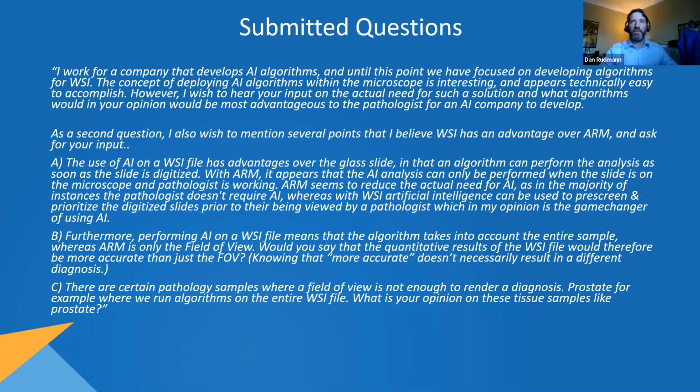I think ARM is equally intriguing and helpful for both spaces, but possibly whole slide imaging AI screening approaches in a non-clinical environment, where we're trying to avoid false negatives and kind of just alert the pathologist to abnormalities, might be a little bit more advantageous for us than the clinical colleagues. But I'd be interested to hear what Liron thinks about that. But that's maybe the only difference, I would say.